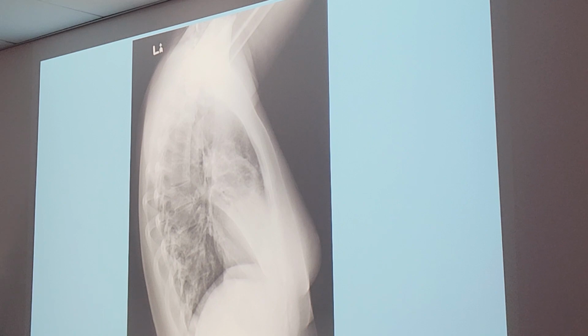The marker doesn't have an initial. Marker doesn't have an initial, okay. The marker should be in the front. Yeah, it should be in the front, okay. What about full inspiration? Did we achieve that? I think we did. Yes. We could have done better. Take a deeper breath.